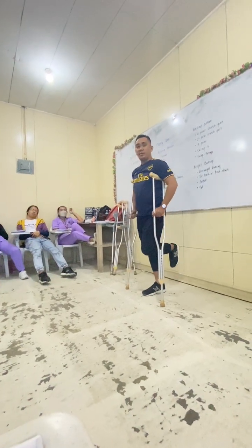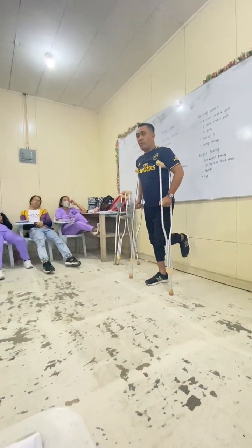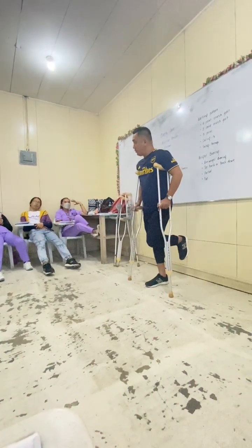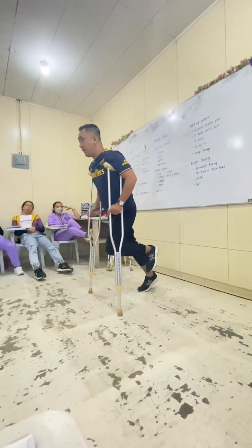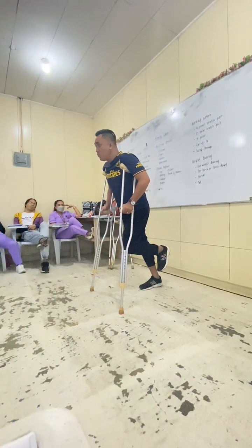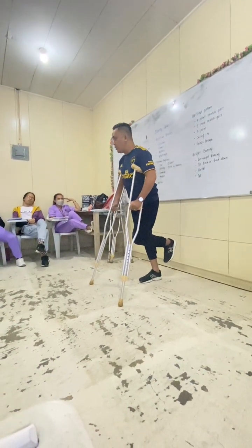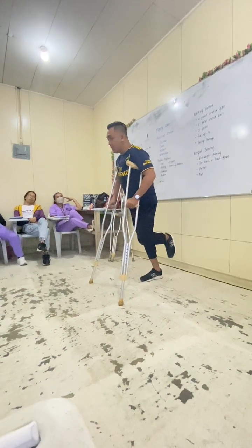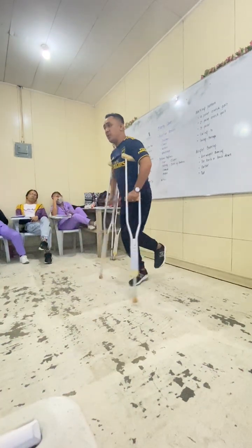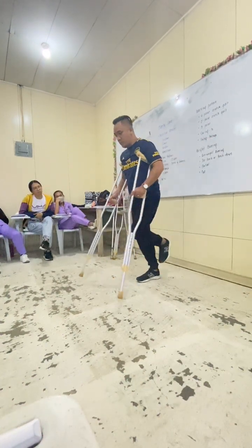Okay. Now, to simplify this one, this is how a patient walks using 3-point crutch gait. So first we are going to advance or forward both crutches together with your injured leg. So dungan as the forward. Okay. Then next is bear all your weight dirigid sa hand grip. Mangusog itang maayo dire because we will carry our body. Okay. Now you have to remember this one. When a patient walks using axillary crutch, especially 3-point, di na sila mo mag-left. They're actually using their upper extremities to carry their body na siya. So how do they walk? Strong triceps.